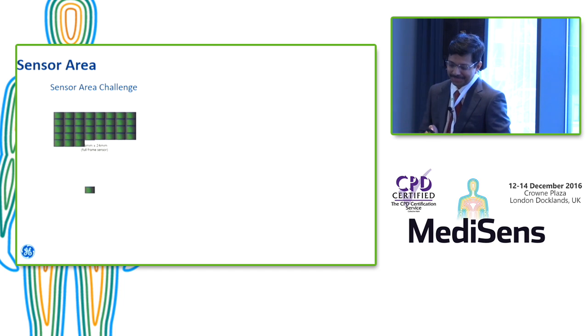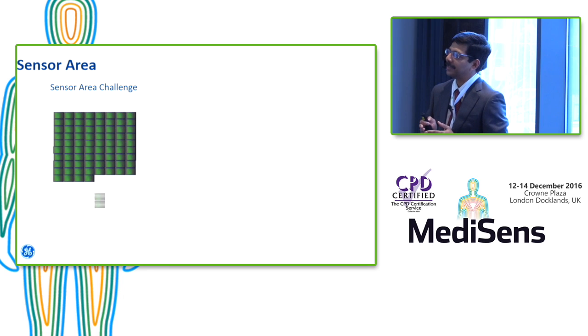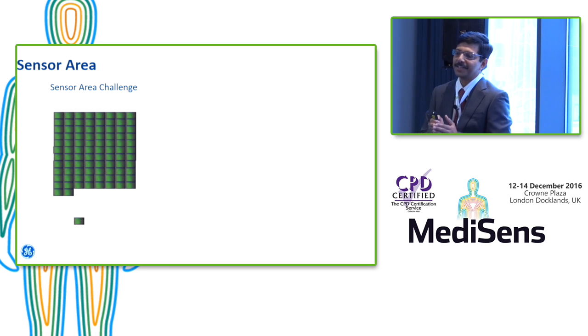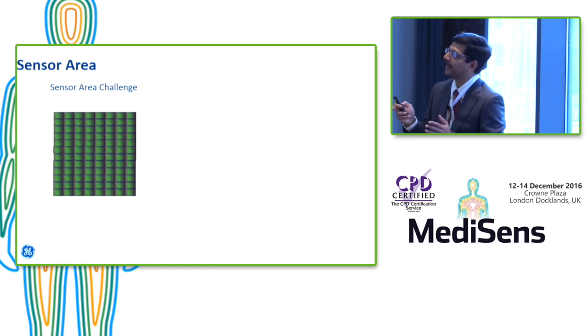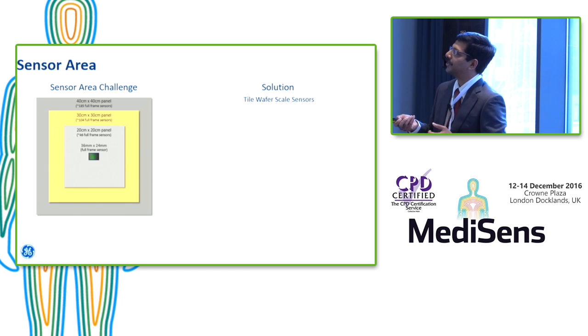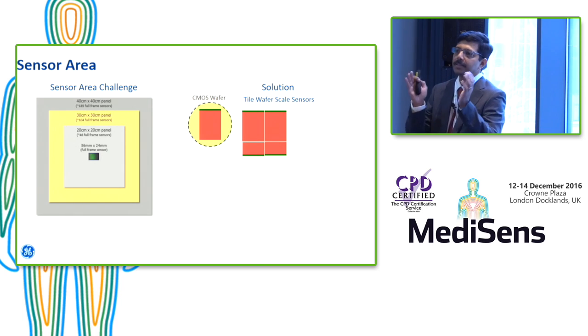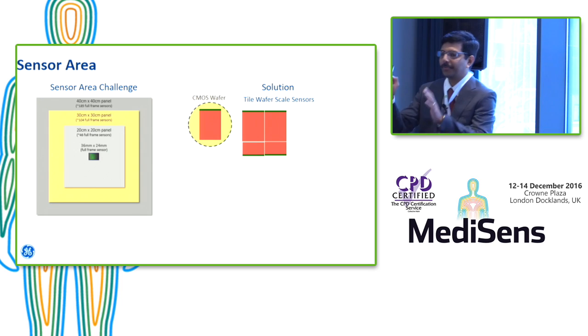you can see that. What I want to illustrate here is the size. The single unit there is a full frame CMOS sensor, which is pretty big from a conventional CMOS point of view. You can see that to build a typical 30 centimeter panel, we have to have almost like 100 of such sensors. So that's the size you're dealing with. And that is only the middle range. And then there is also the 40 centimeter. So it's pretty huge. But we solve that problem by tiling. And so you start with a single wafer. You cut the biggest tile you can have, make it three-side buttable. A lot of technology behind it.